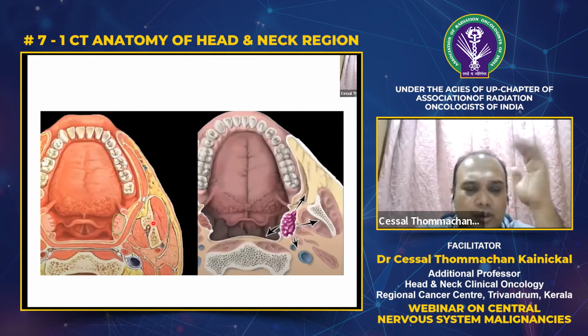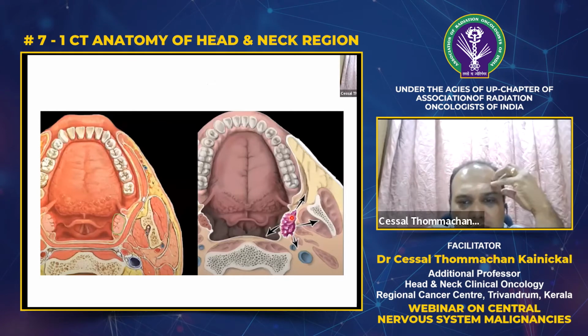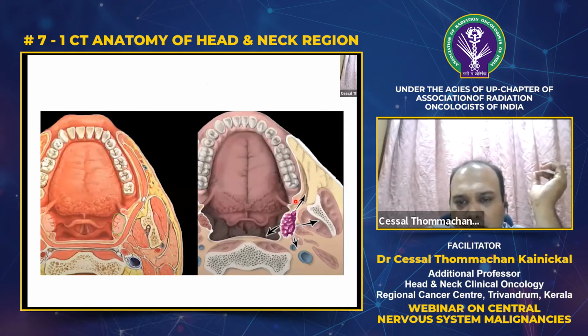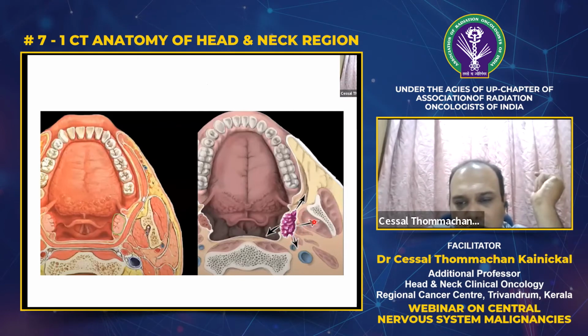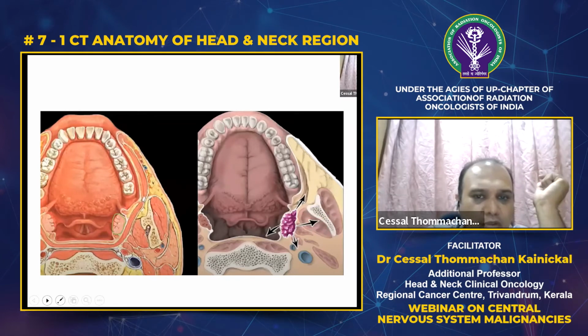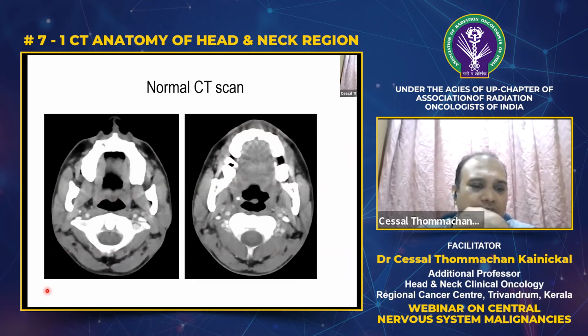Yes, I'm sorry. If you have a tumor there in the tonsil, the lesion can spread into the retromolar trigone. This is through the pterygomandibular raphe. It can spread posteriorly to the carotid sheath here. It can spread into the parapharyngeal space. Then it can spread into the medial pterygoid muscle here, and this I have already discussed. So everything we have seen, we have discussed.